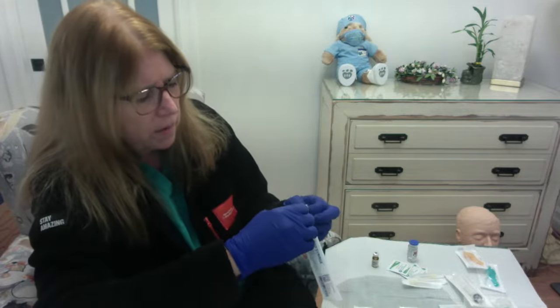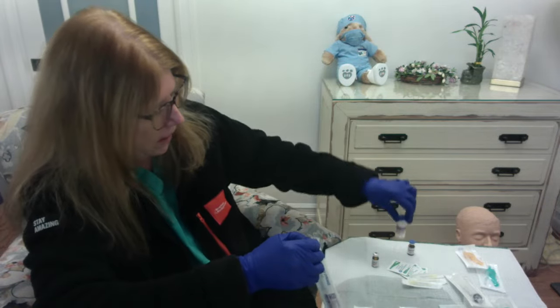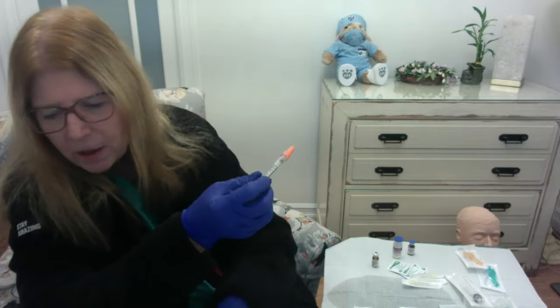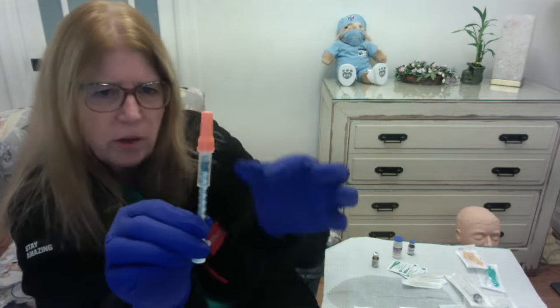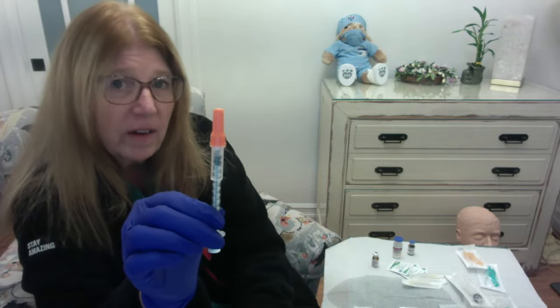So I'm going to open this up because our large vial here is actually a vial of insulin. So let's say that I needed to draw up 20 units of insulin, okay? So this is a different type of syringe now. You'll see this sort of cuff that's on the outside. That is a safety mechanism.